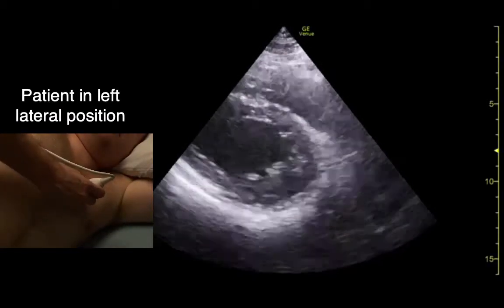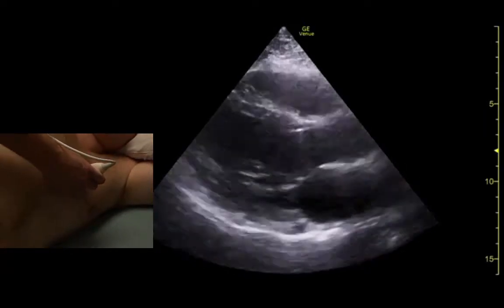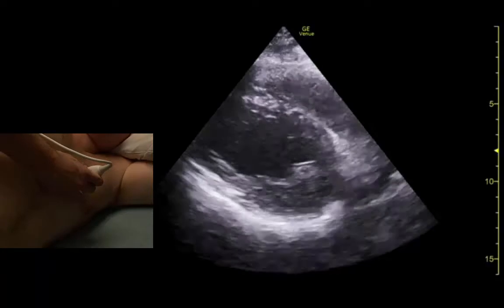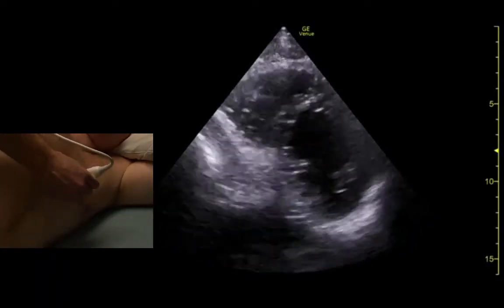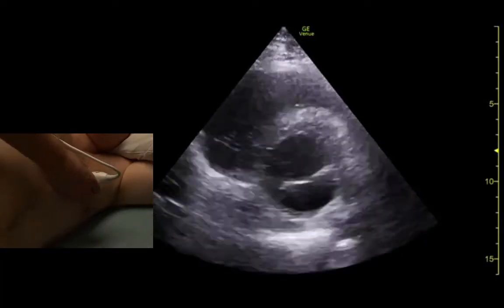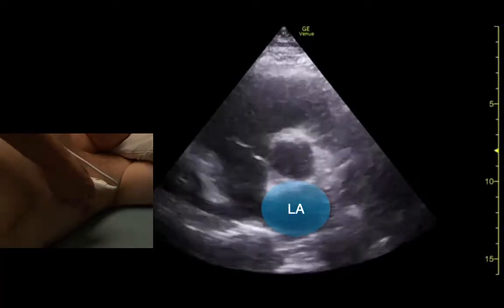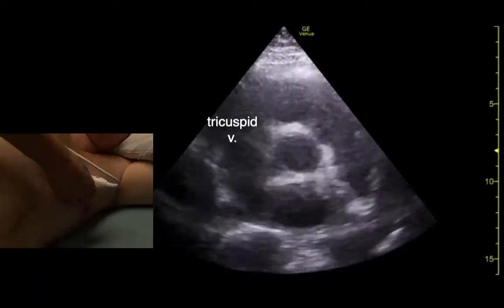We can always get prettier parasternal views with this position. And maybe I can get a better aortic valve view — a little better. On the sides of the aortic valve we see the tricuspid and pulmonic valves over here.